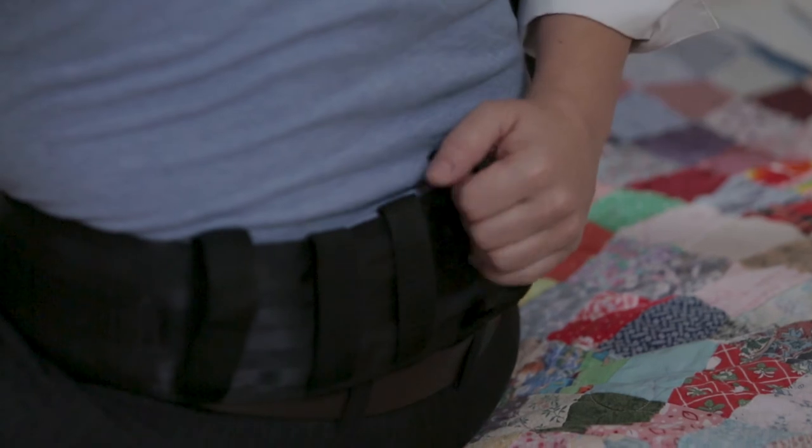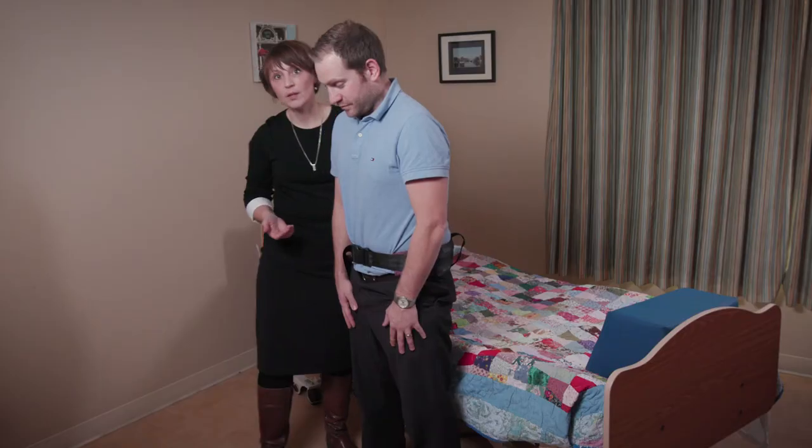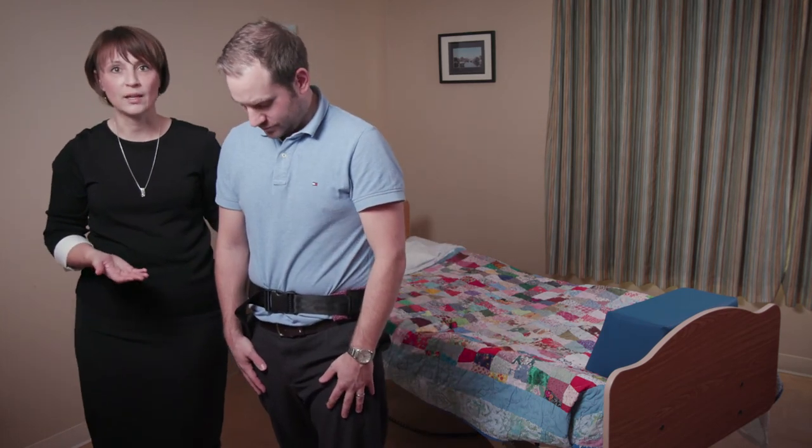So you ready? On three — one, two, three. And then we can walk, and I've still got a hold of the transfer belt, slowly guiding him through his movements.